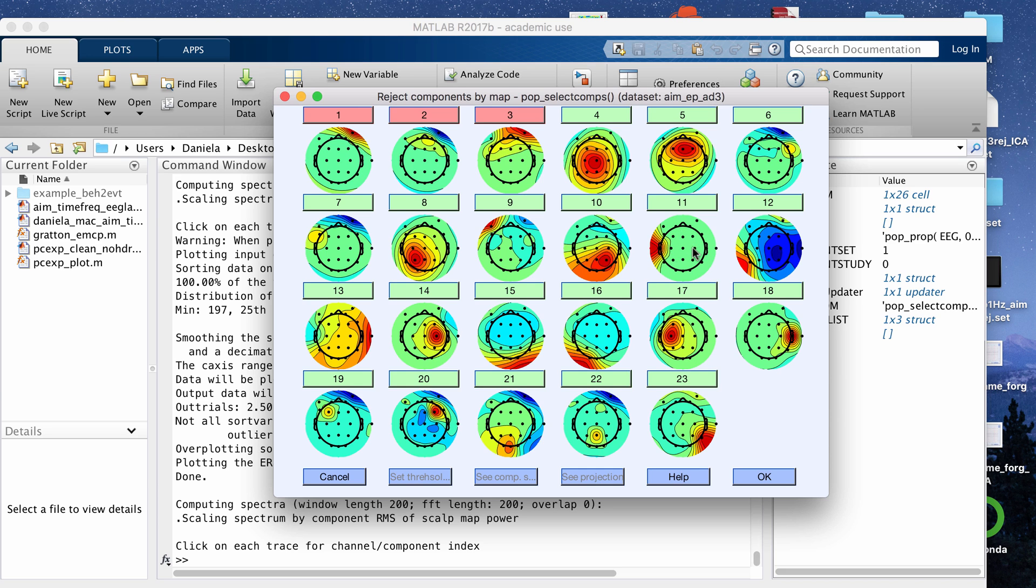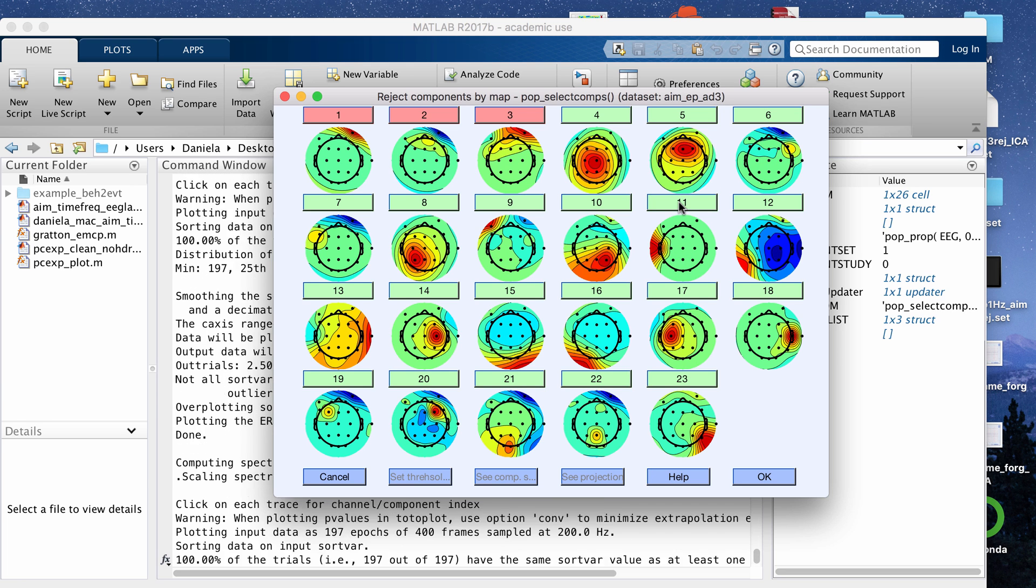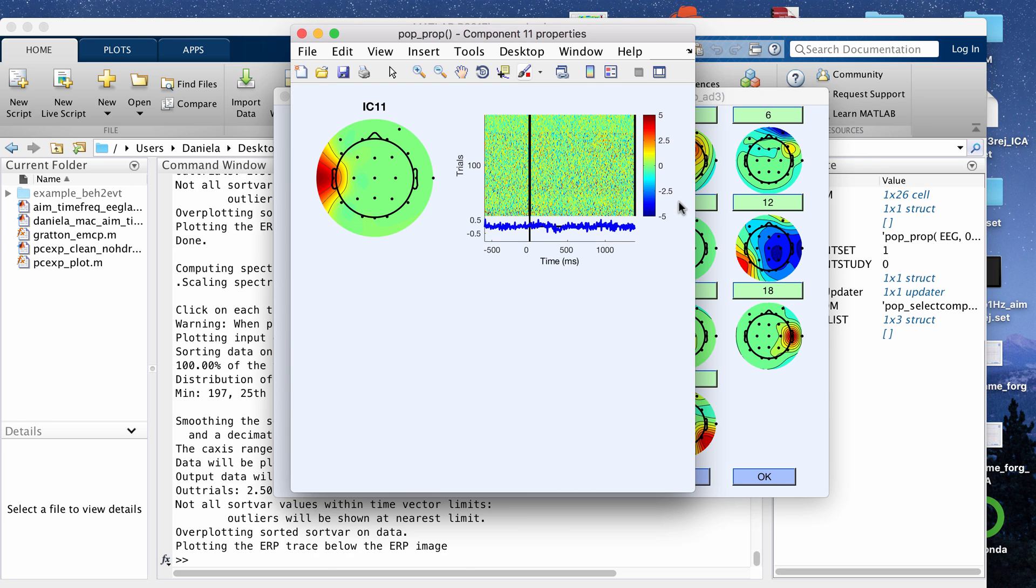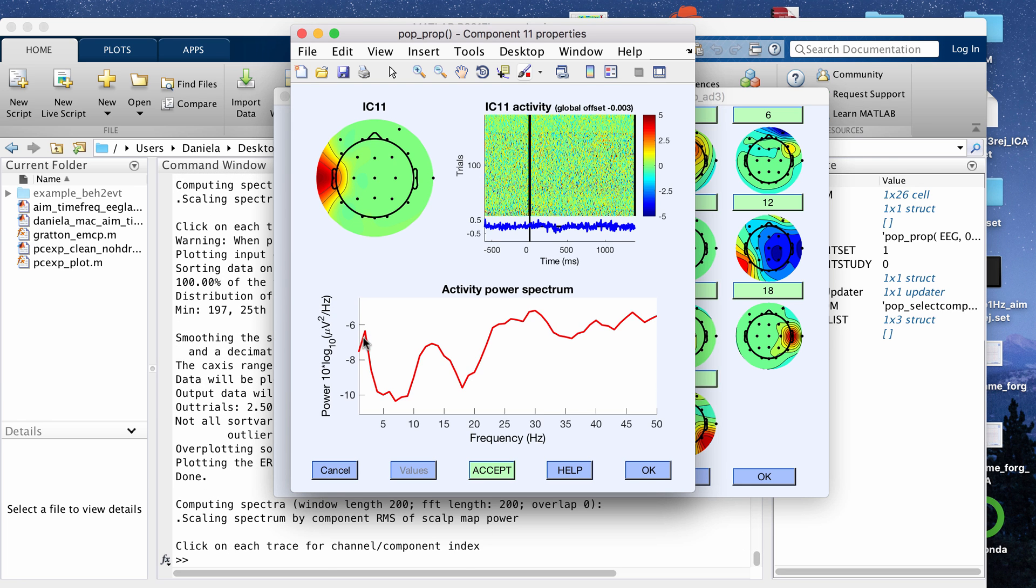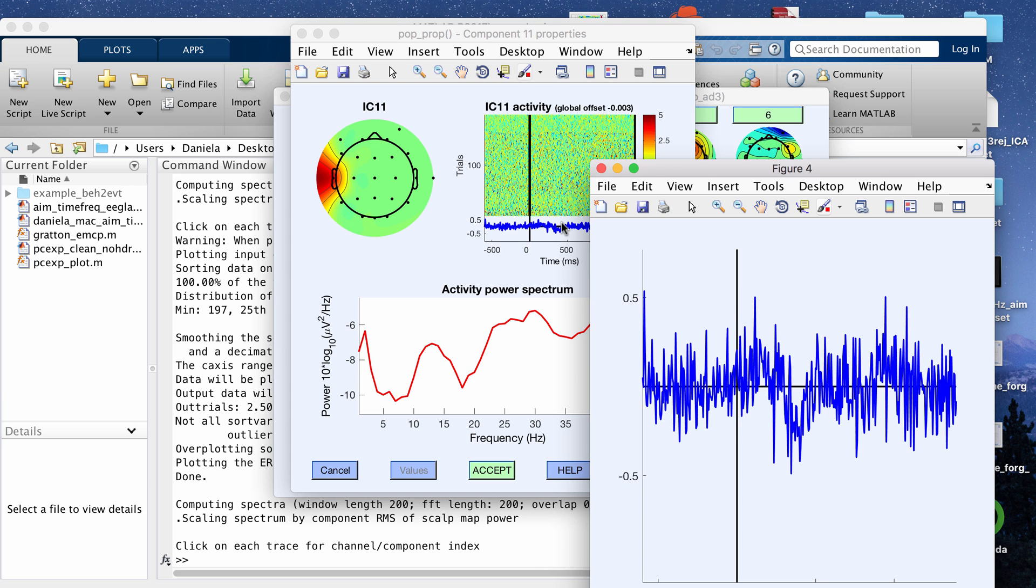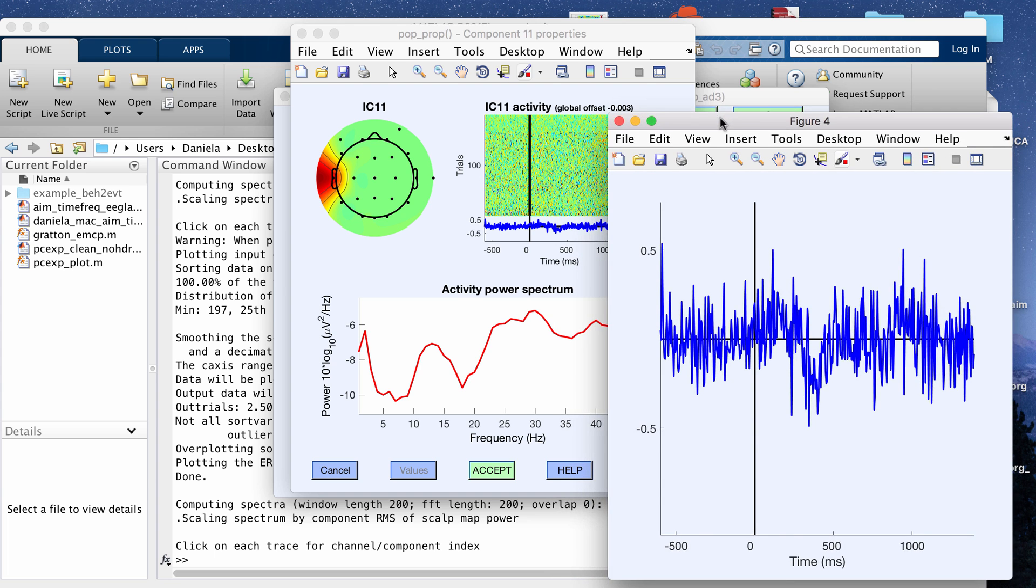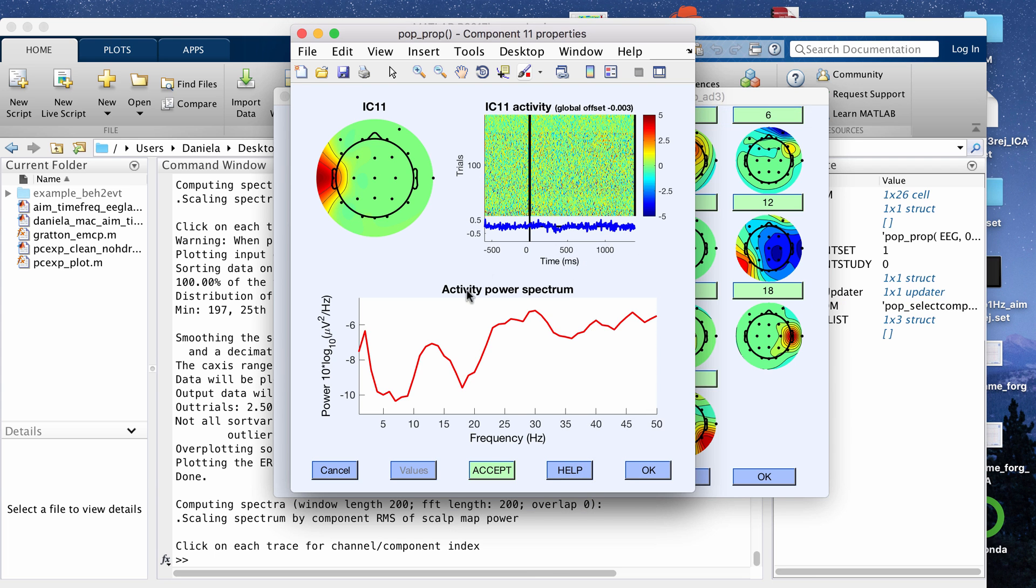You also want to look at the electrodes or the topography maps where it looks like all the signal or all the variance is coming from one electrode. Let's look at 11 for example. This doesn't have a nice 1 over F power plot like you would expect from a good electrode. Then if you click the ERP image, this looks like it's mostly picking up noise. I'm going to mark this one for rejection as well.